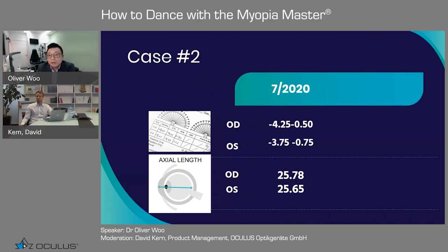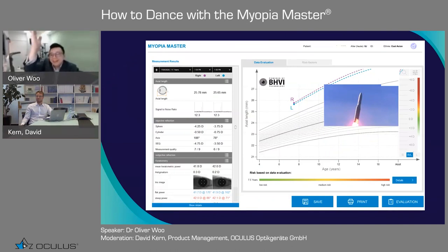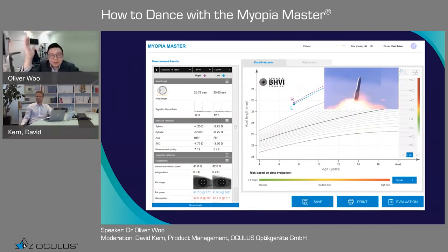Whoa. Very close to 26. It's a danger sign, isn't it? You can see it's going up like a rocket, really, really high. I mean, this is really sad. We will see this case is a sad case. So the chart helps the parents, and helps us present this much more easily. They can visualize what is happening.